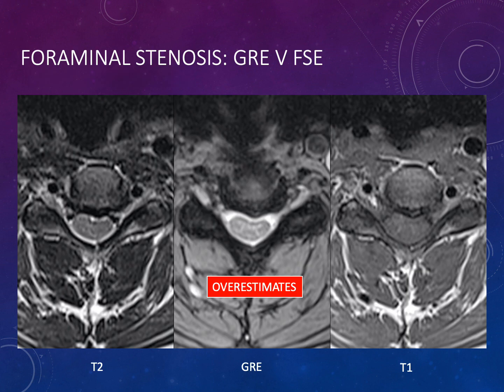Moving from the canal to the foramen: gradient echo imaging provides nice thin-section images of the cervical spine, but these sequences are prone to artifact. They tend to expand bone — a so-called blooming artifact — causing apparent narrowing of the foramen. Foraminal narrowing is therefore often overestimated on gradient echo images. Comparing the T1, gradient echo, and T2 images side by side, you can see the gradient echo shows much more narrowing of the left foramen than the other sequences. So be careful when calling foraminal narrowing on gradient echo images.